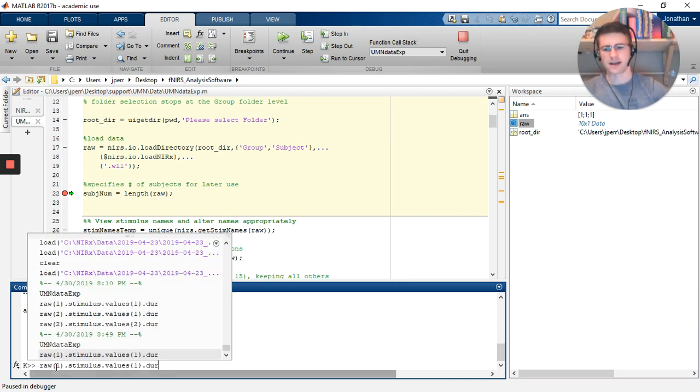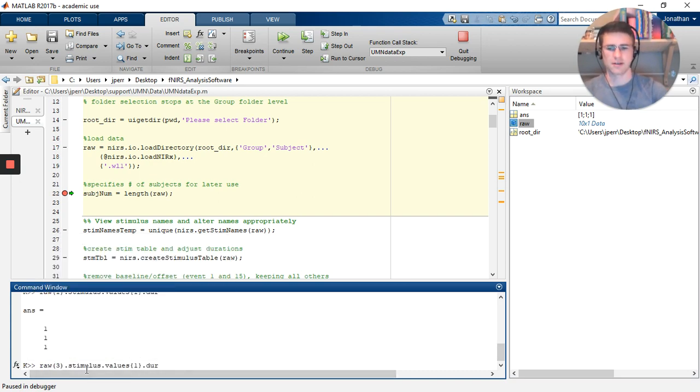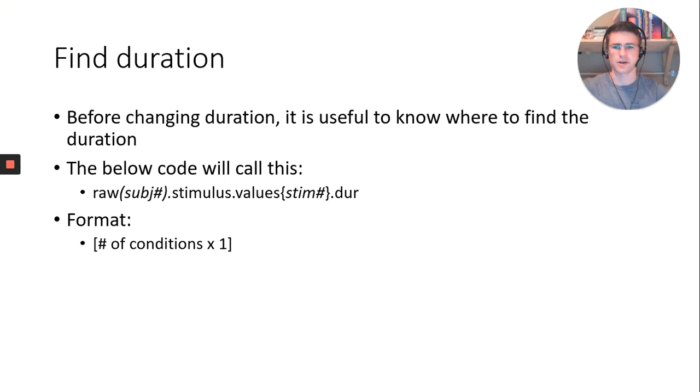If I want to alter this, I can do subject 3, values 1, I get the same output there. If I wanted to change to condition 2, I would do condition 2. All the conditions are the same. That may not always be the case, but for our sake today, that's what we'll go with. Keep in mind, the format of this output will be the number of conditions as your rows by one column.